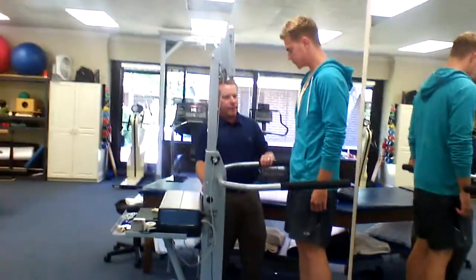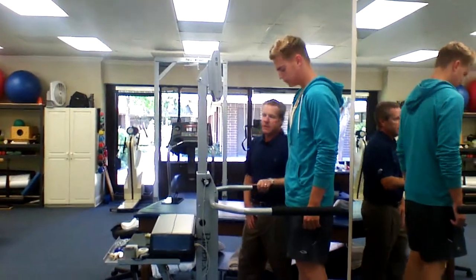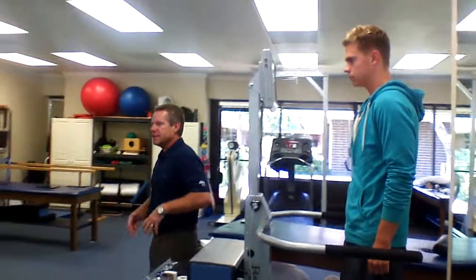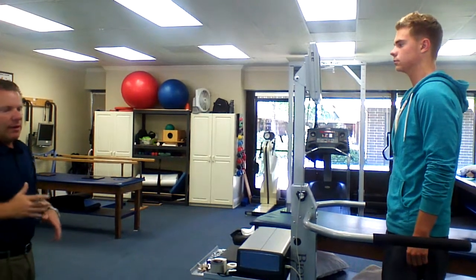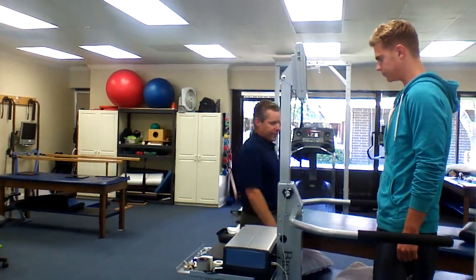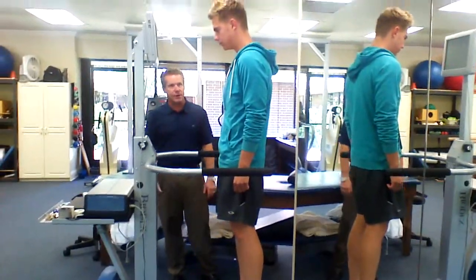We're going to do the Biodex limits of stability test, and this is something good for the hips. The test does not move the ankle part of the machine, so it requires you to use a hip strategy. Whenever you do the training and put it on level 12 or below, that's going to require you to use more of the ankles. So although it requires more balance, sometimes it's easier because people use their ankles a little better than they use their hips.